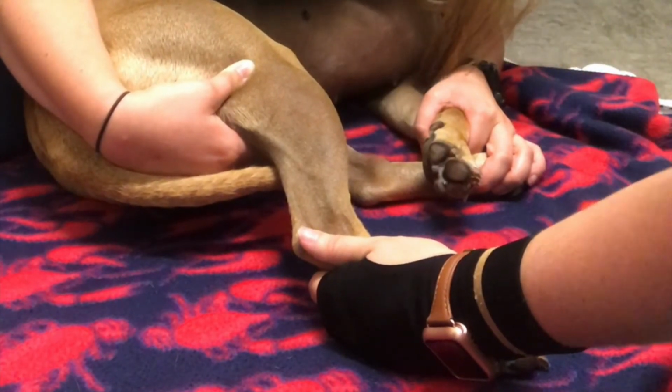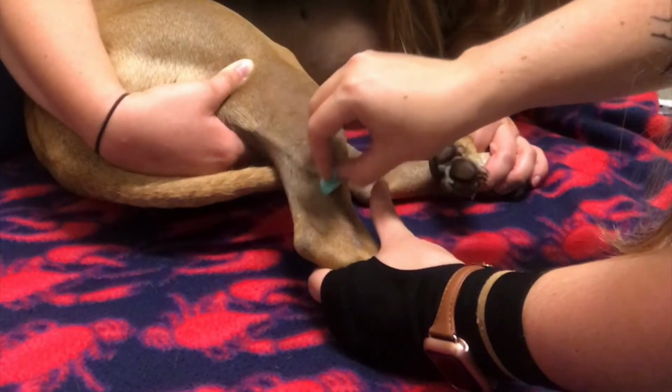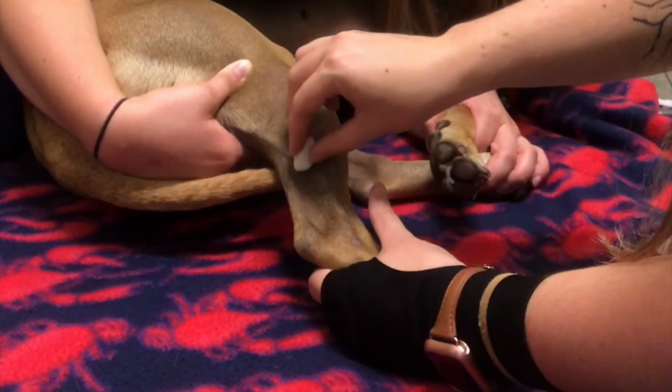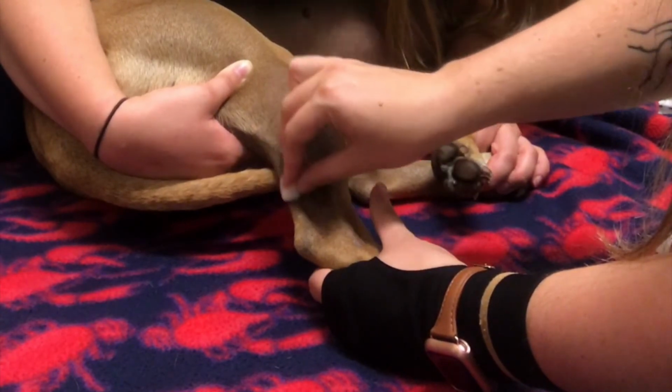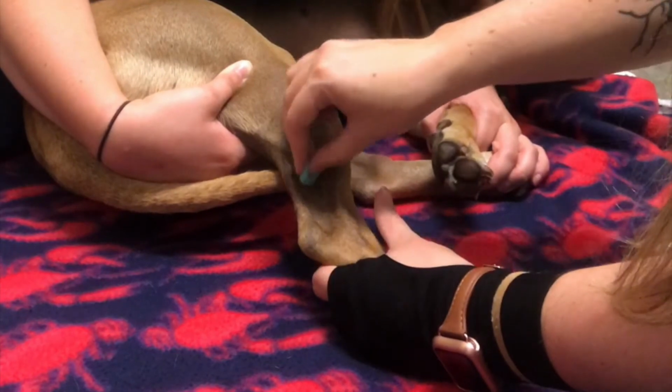Now we're going to do a bullseye scrub with Chlorhex. And then alcohol. We're going to do that 3 times.